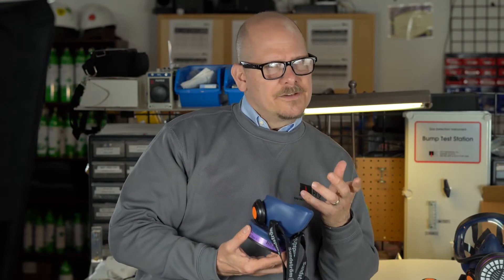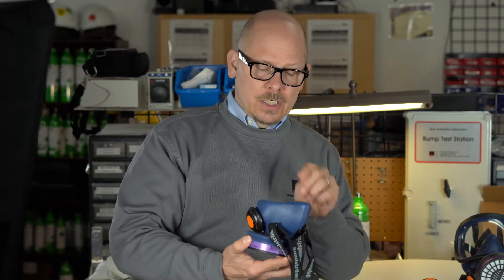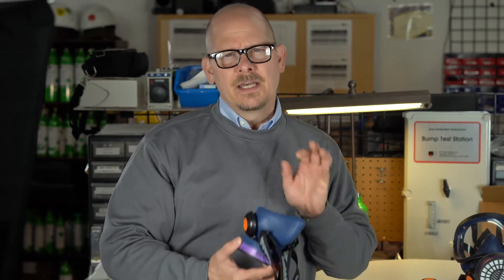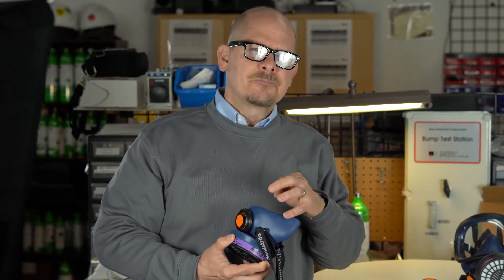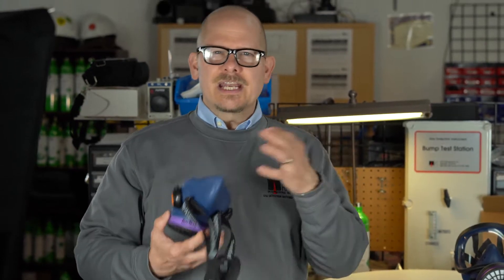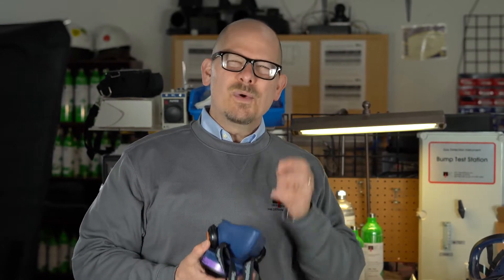We can do qualitative fit testing — that's the smelly stuff, Bittrex, saccharin, irritant smoke, all that kind of stuff — or we can do a quantitative. Even though you don't need to do quantitative fit testing on a half face mask, you only need a fit factor of 100, I highly recommend it. OSHA says you've got to meet a pass of 100 fit factor on a half face. But as safety engineers and safety professionals, we want the best fit, not just a mere pass-fail.